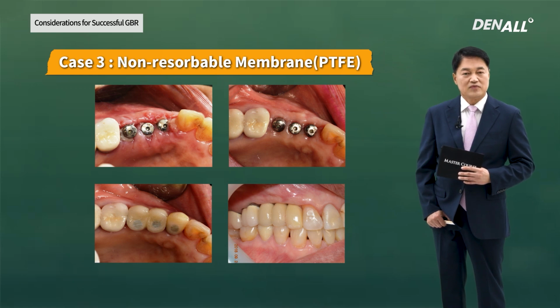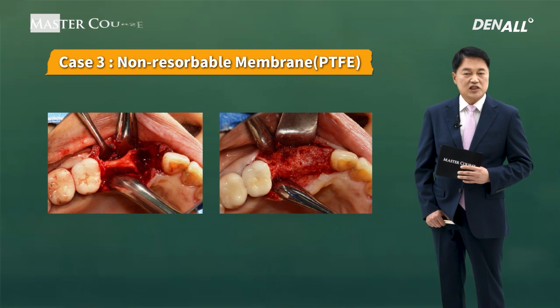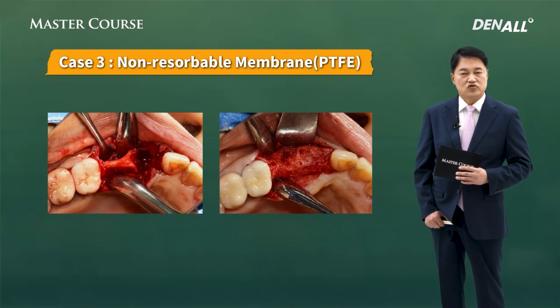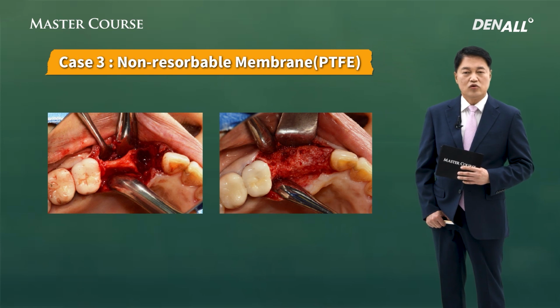As you can see, before GBR and after GBR, it was very difficult to place the implant here, so GBR was done appropriately, and now we can see that there's no problem in placing an implant.